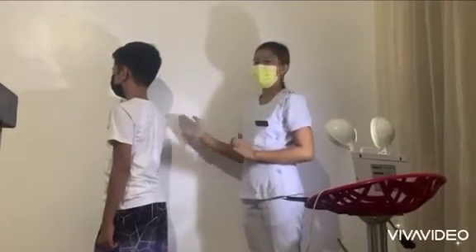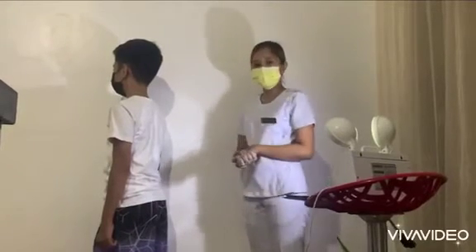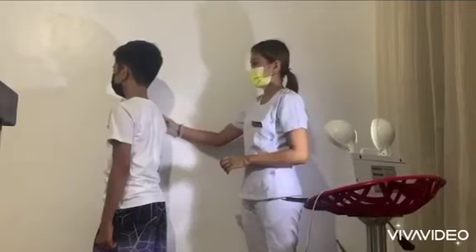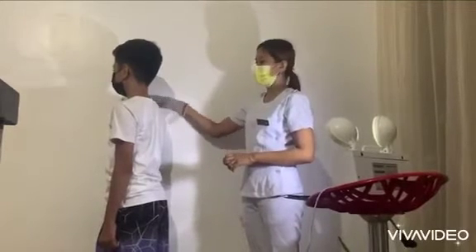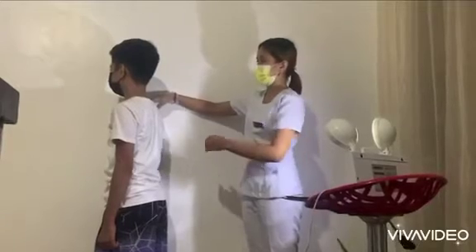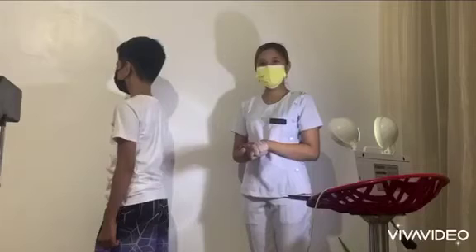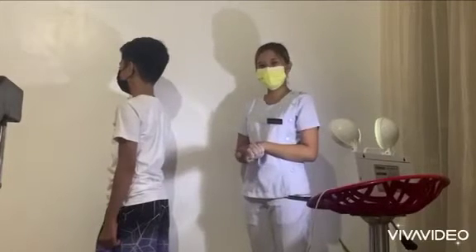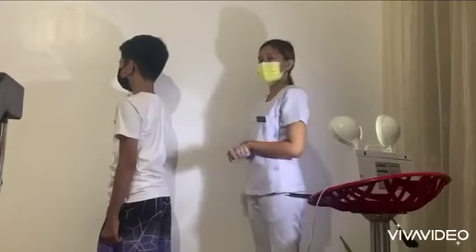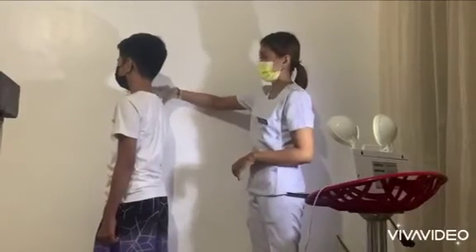So you're going to have to collimate, and you're going to feel the acromion. You're going to feel the end of the clavicle, and you're going to do the hand like this. And this line should be coming straight, or it should be longitudinal, coming through my hand like this.